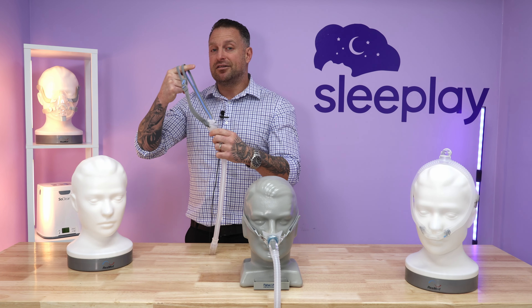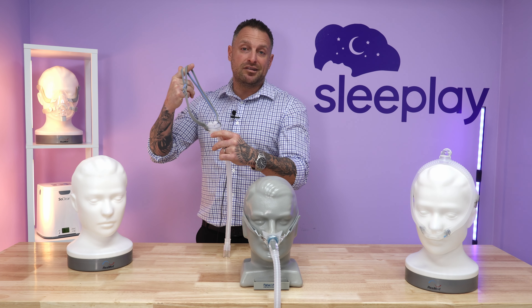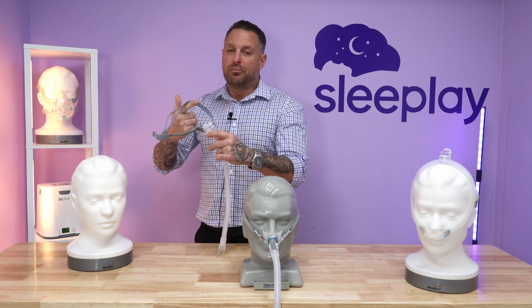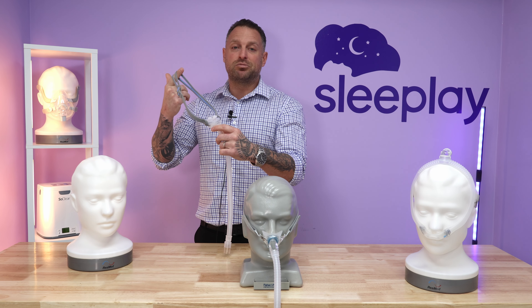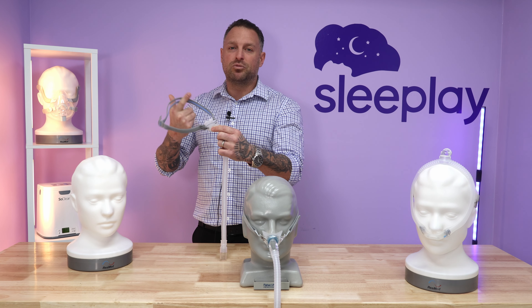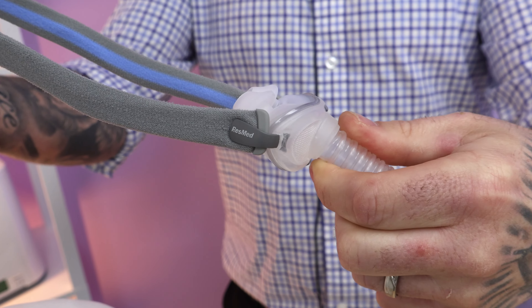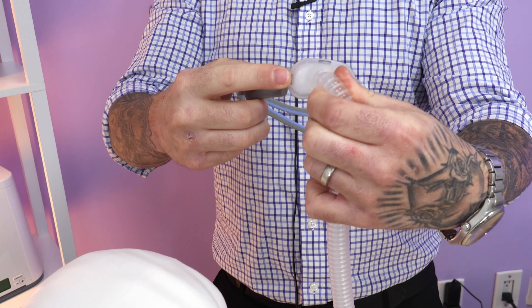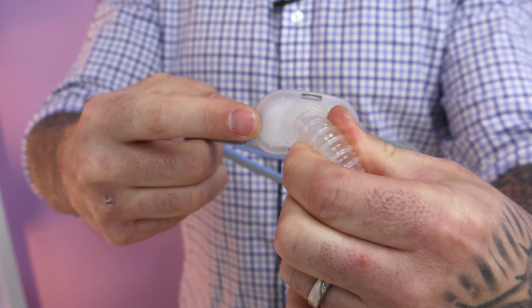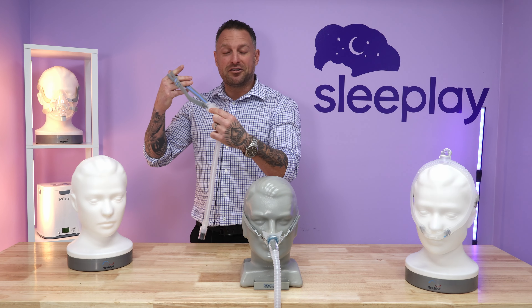The universal one is blue and gray. The women's is specifically pink and gray, but some gentlemen have used that as well. If you do have a small head and need a little smaller headgear, you can go with the women's — it's just the color. You're sleeping, no one really sees it. As I tell everybody, some people care what they look like in the middle of the night — I don't know why, but it is what it is. This is the AirFit P10 by ResMed — it's a great mask.